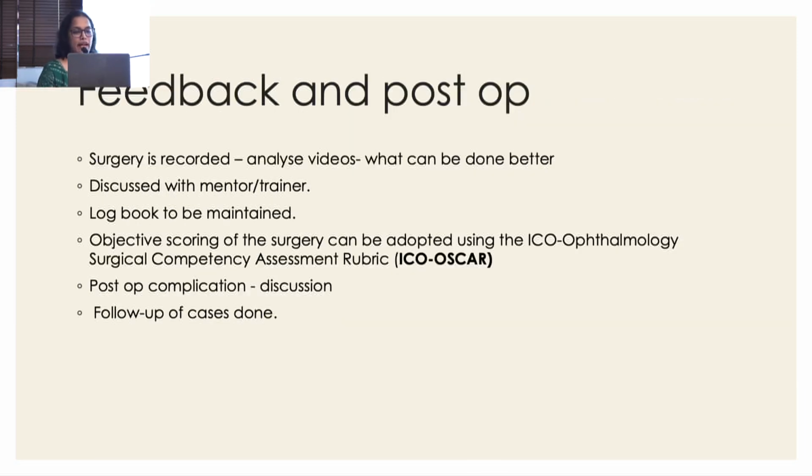And then feedback and post-ops. Find a good mentor; it is also very important. Record your surgery videos and analyze your own videos: what can I do better in the next case, why my nucleus didn't divide, what happened. Keep a logbook, use the OSCAR scoring system, and follow up cases and post-op complications. Everything is very important in phaco training.